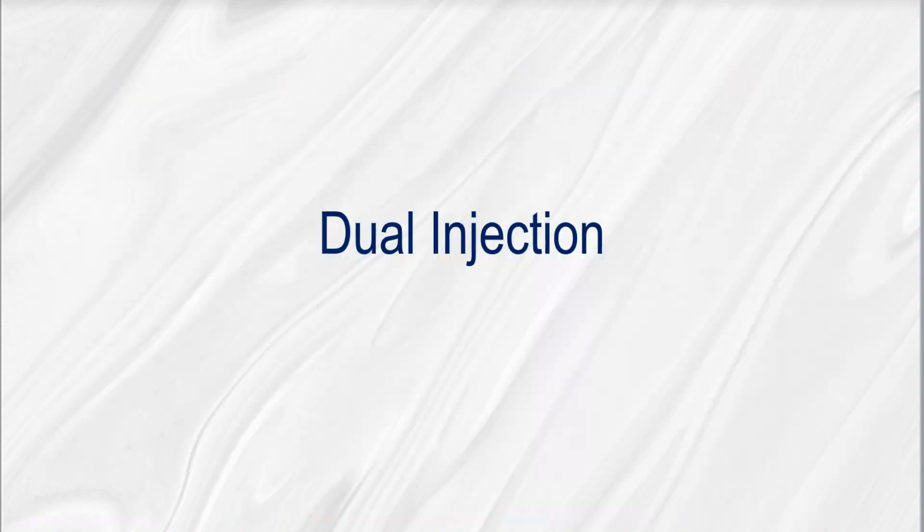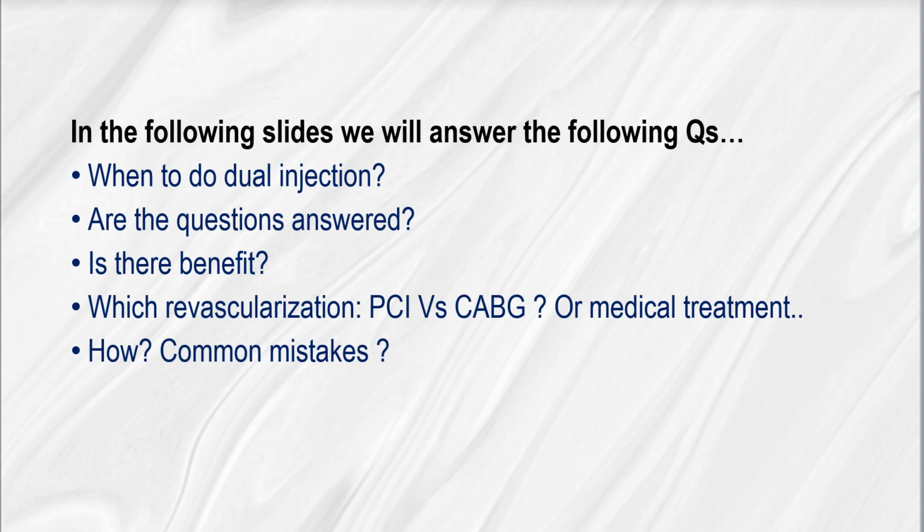Today's topic is about dual injection. In this video, we will answer the following questions. When to do dual injection? Are the questions answered? Is there benefit? Which revascularization strategy? PCI versus CABG, or just the medical treatment? How to do it, and what are the common mistakes?